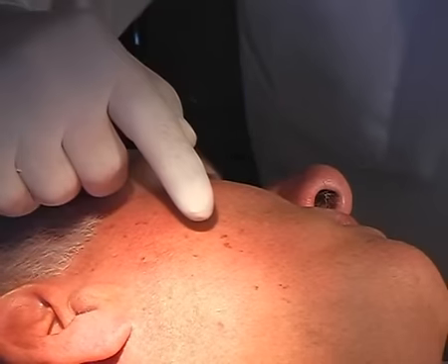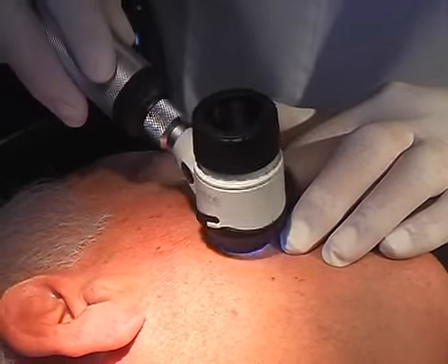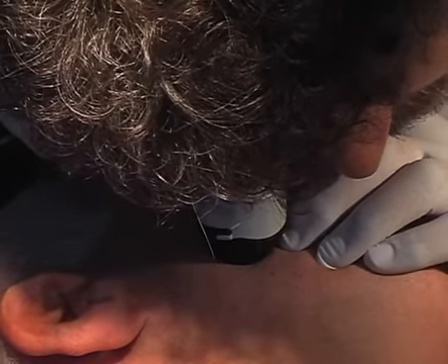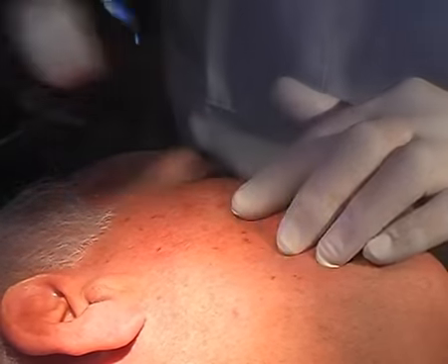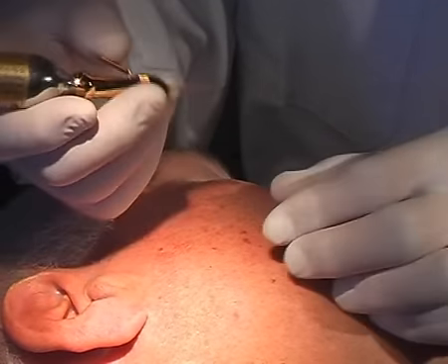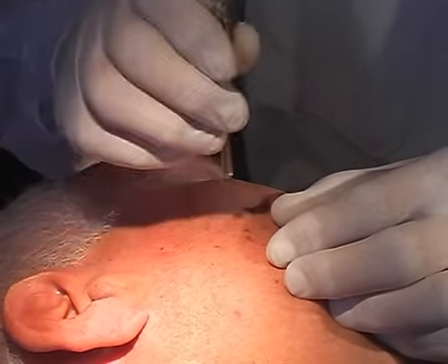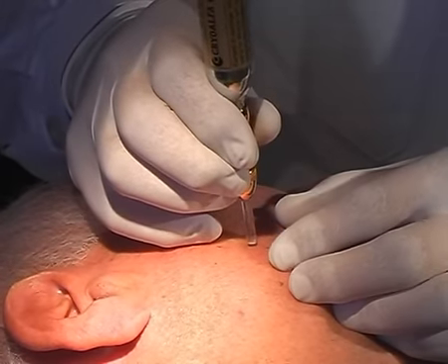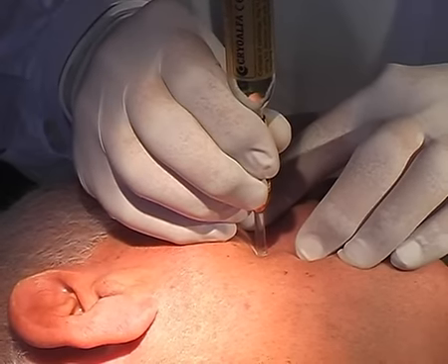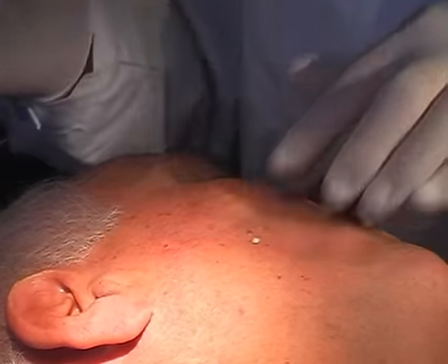This patient is 58 years old and has a small, light brown tumor. The examination with the dermatoscope clearly shows that it is a seborrheic wart. With the cryo-phalux equipped with a 4 mm tip, we are going to treat during 5 to 7 seconds. After approximately 10 to 14 days, the wart will fall off.